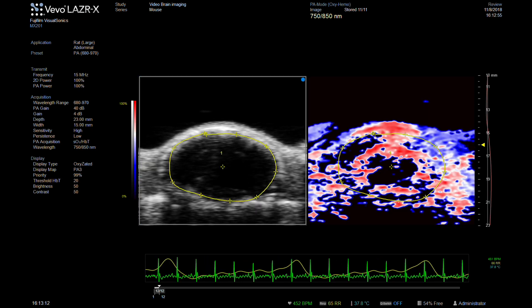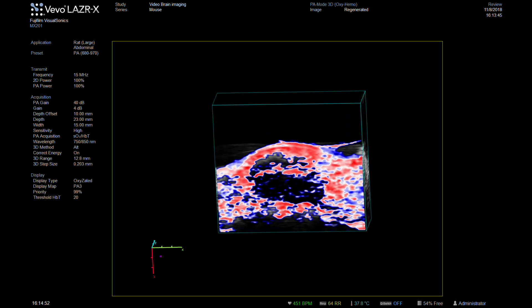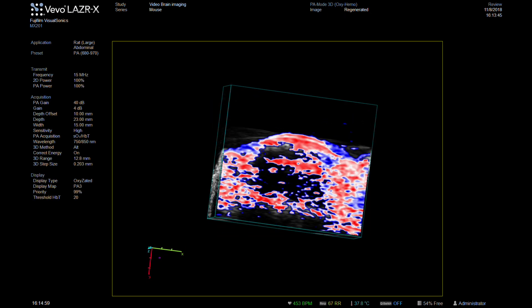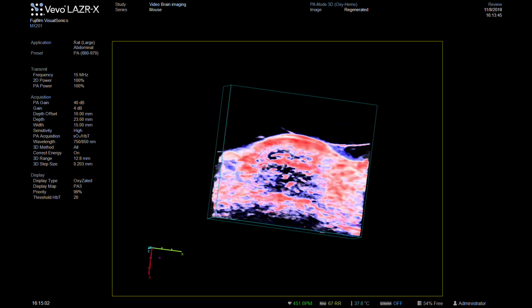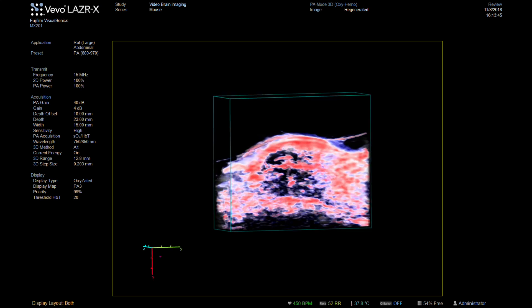Setting the laser to oxygen saturation imaging mode creates a parametric map showing the average oxygen saturation of the brain tissues. Red areas indicate highly oxygenated tissue; blue shows the more hypoxic regions. This can also be done in 3D, allowing the degree of oxygen and hemoglobin saturation to be calculated across the whole brain.